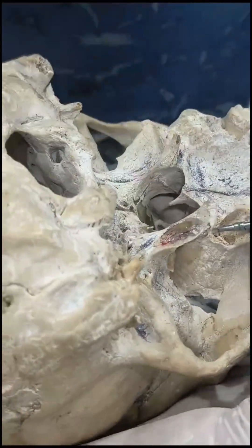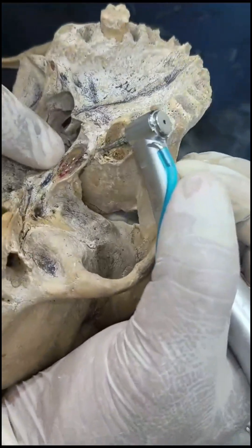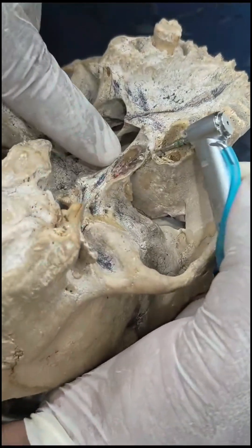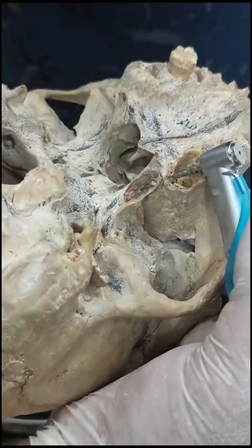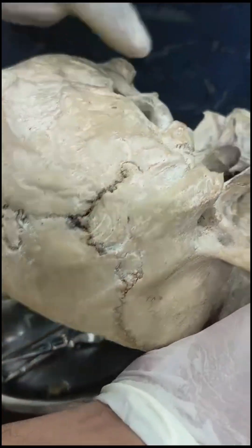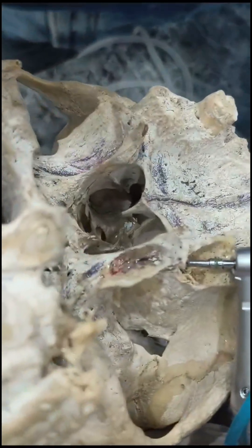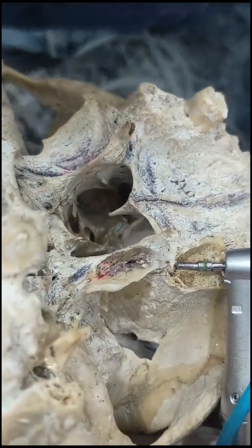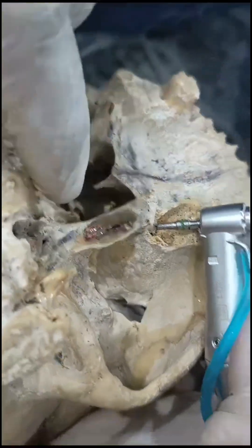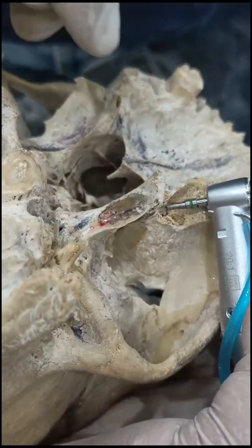The drill is in the pterygoid fossa, between the two pterygoid plates, directed towards the medial pterygoid.